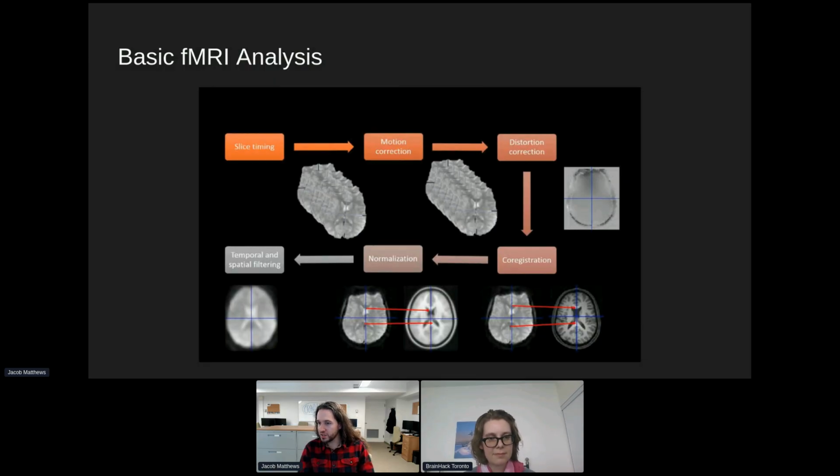You can compare them across subjects and scanners more freely than you can with relative weighted imaging. For example, if you have T1 and T2 maps of your data, you can generate a virtual image using any weighted contrast. The T1 and T2 values determine the weighted imaging and how they look. So if you have that raw information about the brain, you can generate a pretend image as though you would run any T1 or T2 weighted sequence.